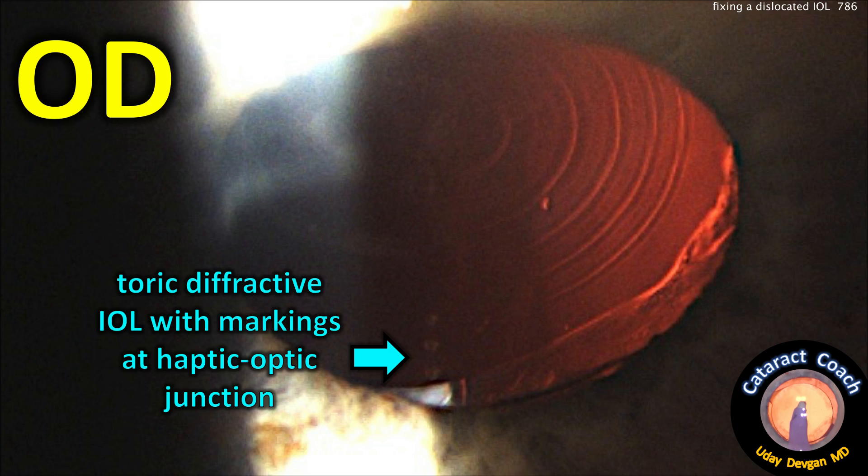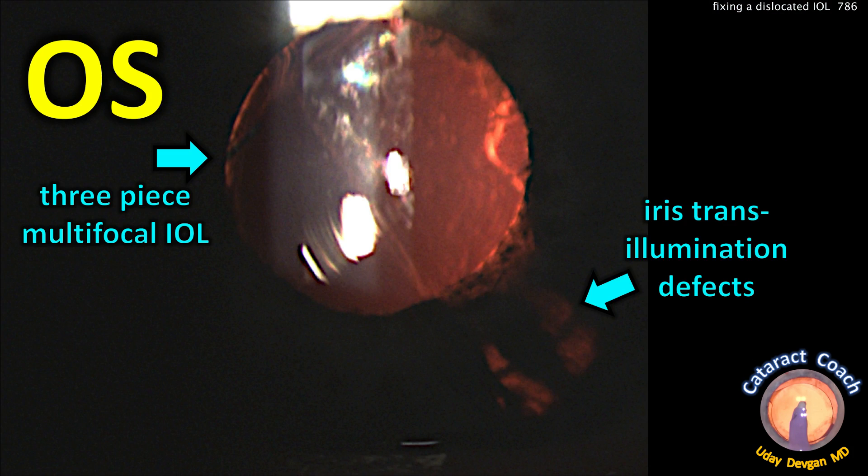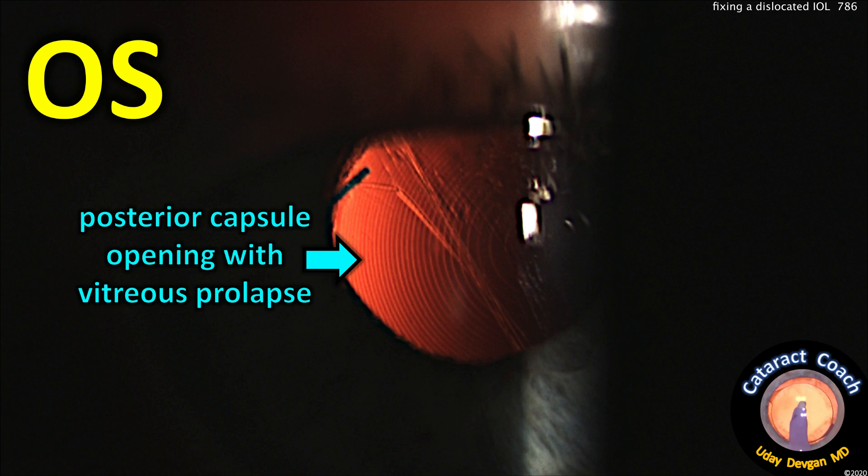Looking at the right eye, at the haptic-optic junction, we can see the toric marks. The left eye's problem is the three-piece multifocal lens is decentered. There's some iris transillumination defect, and the center of this lens is not close to the center of the visual axis. We see an open posterior capsule with some vitreous prolapse leading to the lens shift.